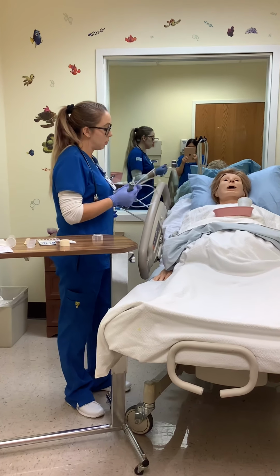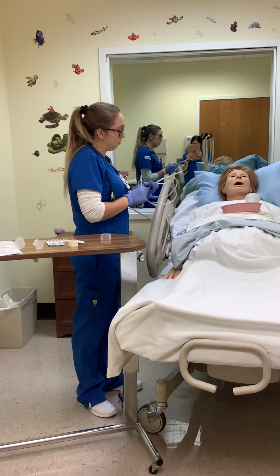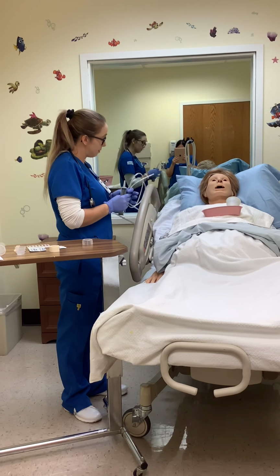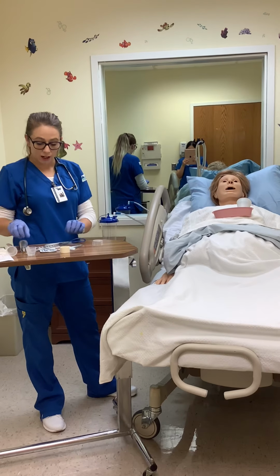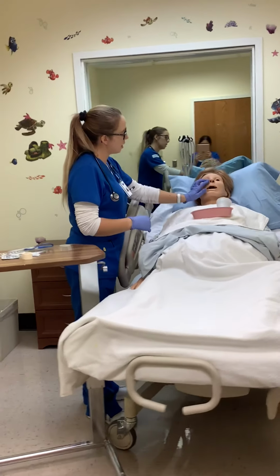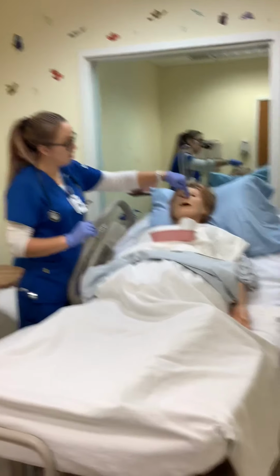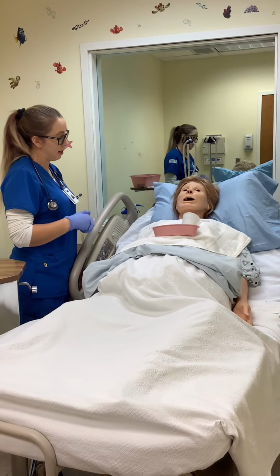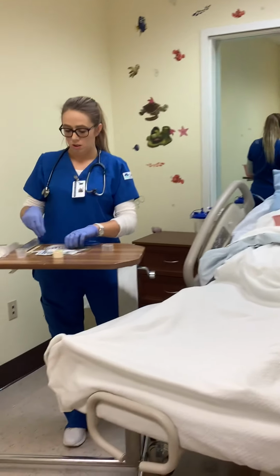I'm going to insert this through your nostril, and it's going to go down your throat, and basically it's going to be uncomfortable at first. You might experience some gag reflexes, but it will feel better afterwards. Now before I do that, I want to know which nose to do it through. I'm going to plug up this nose here, and I want you to blow air out. Good. Now on the other side. Good. Now which nostril felt like it had the best airway? The left one. Okay, perfect. So we'll just go through that one.